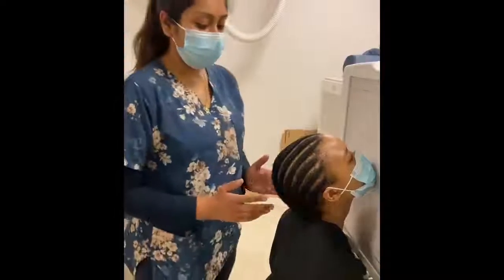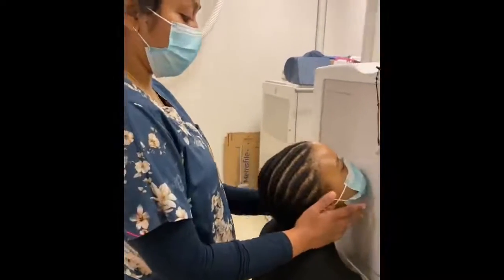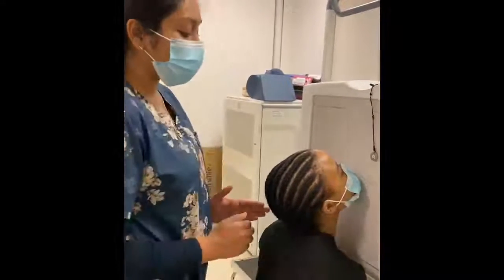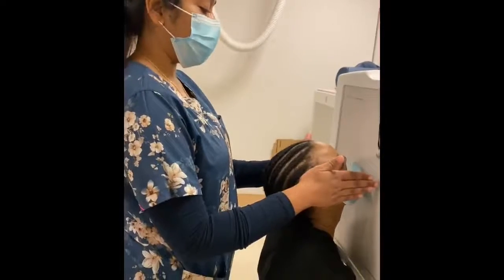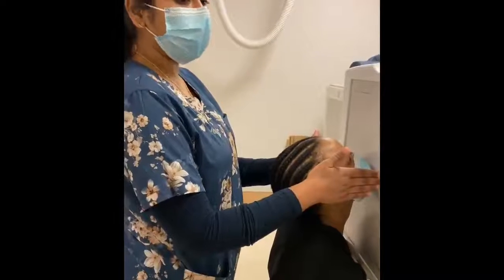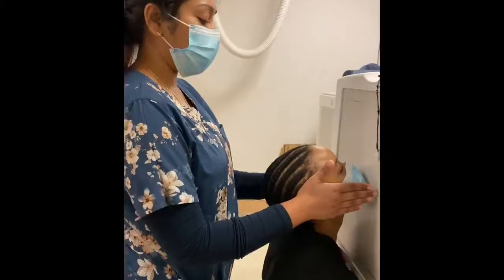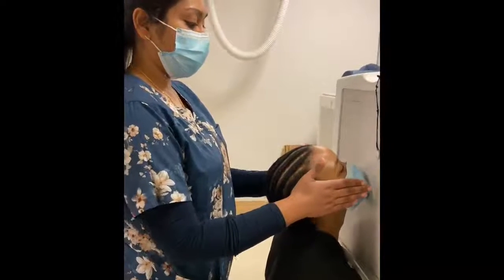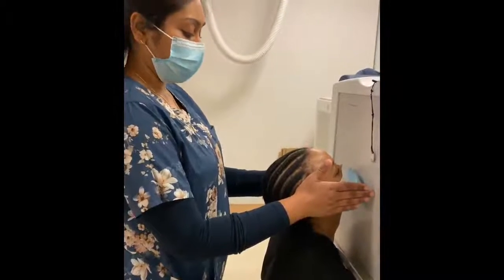Okay. From here, we also need to make sure that our patient's head is in the mid-sagittal plane. So we adjust our patient slightly in this position. And then to check for rotation, you can use your thumb and your fingertips. Place them at either side of your patient's face. Remember, be careful of how you're touching your patient as well. And then we just need to adjust the patient so that there is no rotation. So it should be an equal distance on either side of the patient.